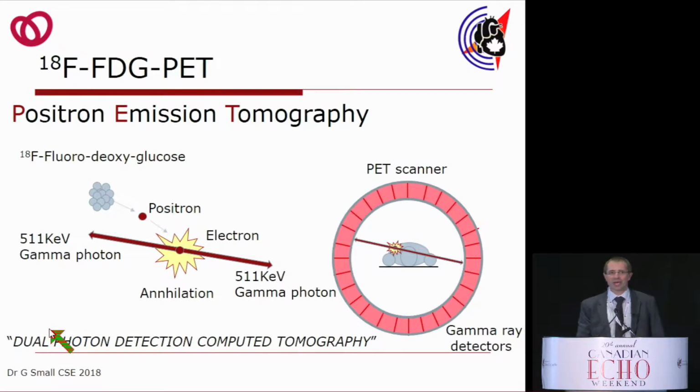So a few words about PET imaging. PET imaging uses radiotracers that decay by positron emission. The positron travels a short distance. It hits an electron. That collision is an annihilation collision. It generates two diametrically opposed photons. So we need a specialized camera to pick that up. You can't use the traditional SPECT cameras because you have two diametrically opposed photons being released.